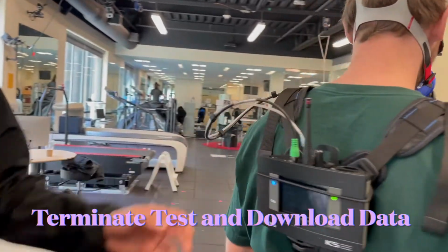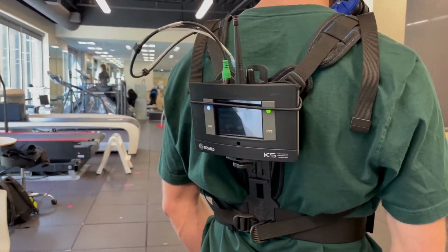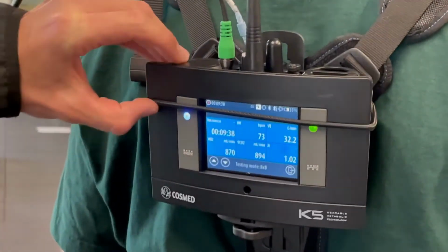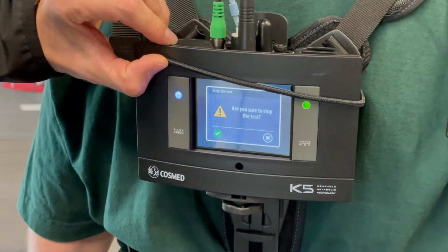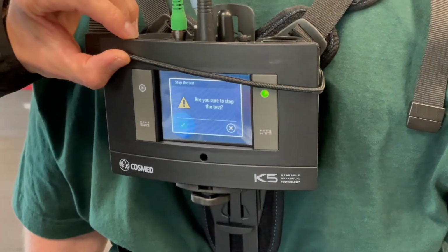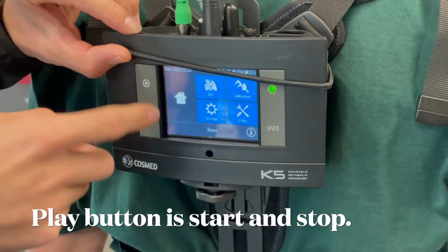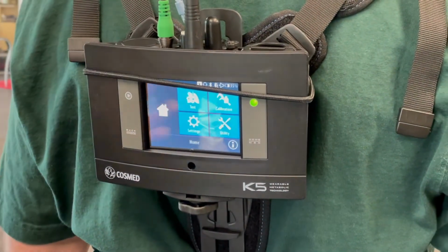Right, we're good. Okay. So now we basically just want to terminate the test that he was running. So we'll just go here and we want to hit this guy here. Are you sure you want to stop the test? Yes. So, I mean, it's only a play button, but it is our start and stop. Right? Okay, so everything's done.